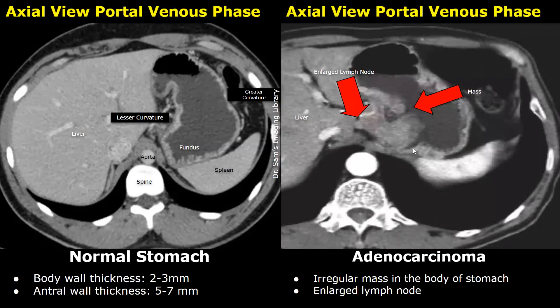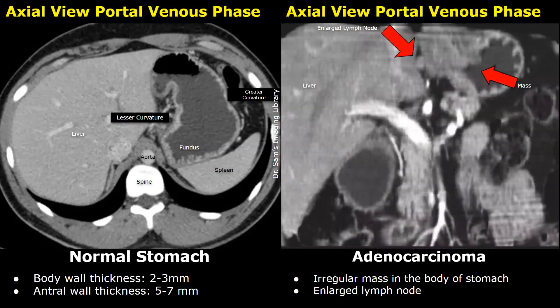In this image there is an irregular mass in the body of the stomach and there is an enlarged lymph node outside the stomach. This rounded high-density structure is the enlarged lymph node, suggesting advanced stage cancer. In the coronal plane we can see the irregular mass and also the rounded enlarged lymph node.